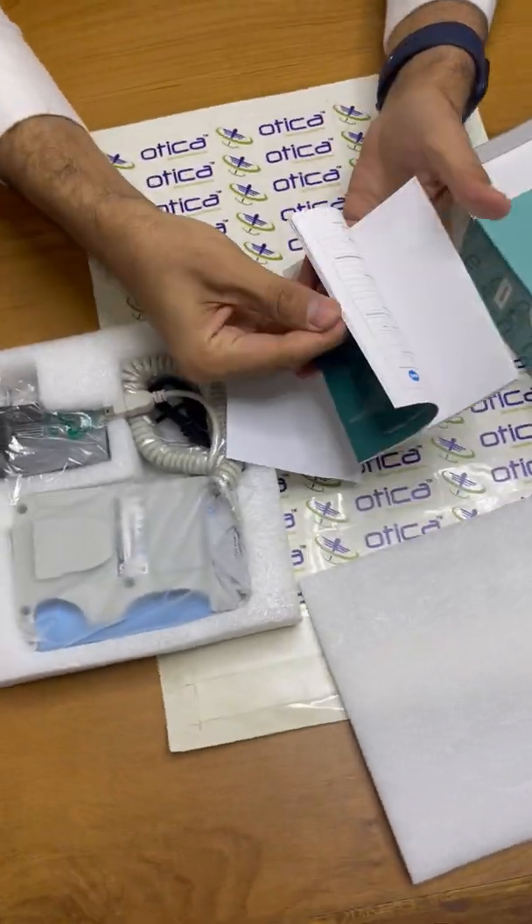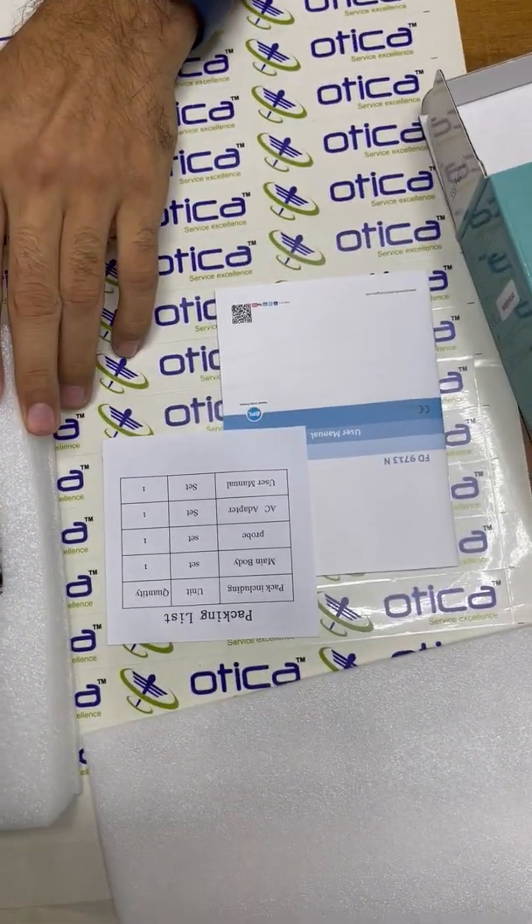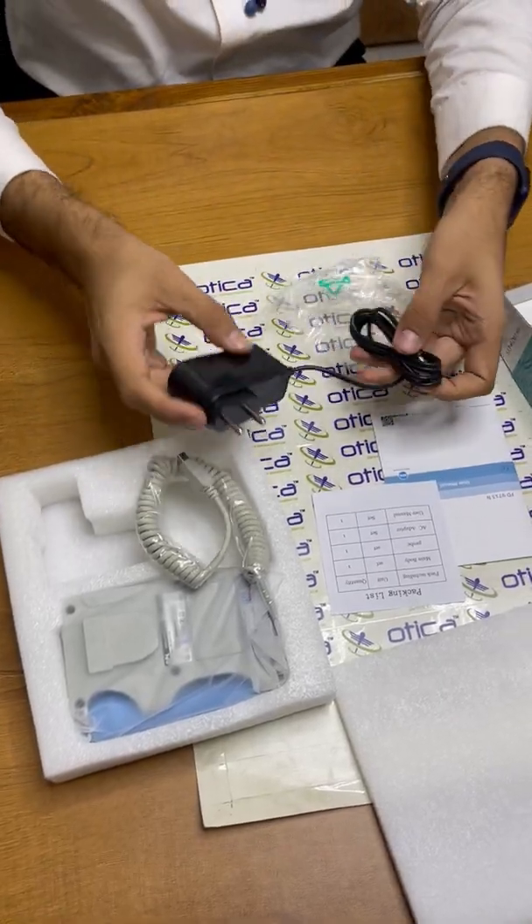The device comes with a user manual and a packing list. This is a rechargeable device and this is the charger that comes along with it.